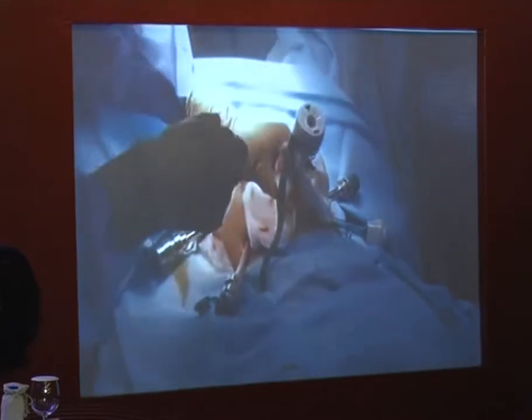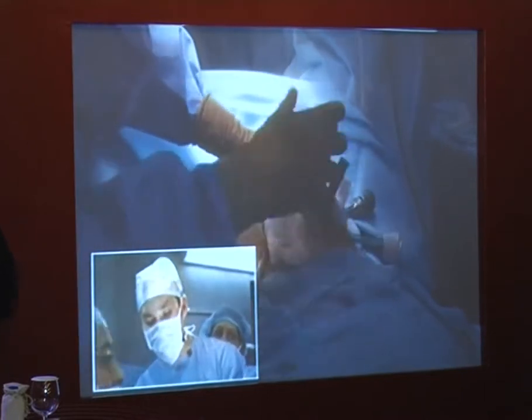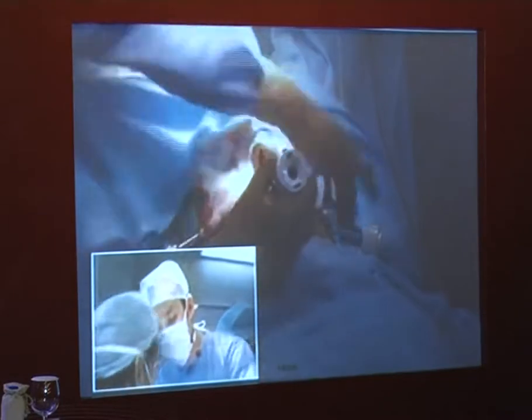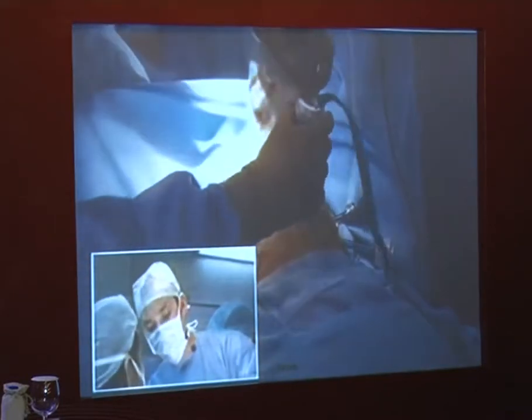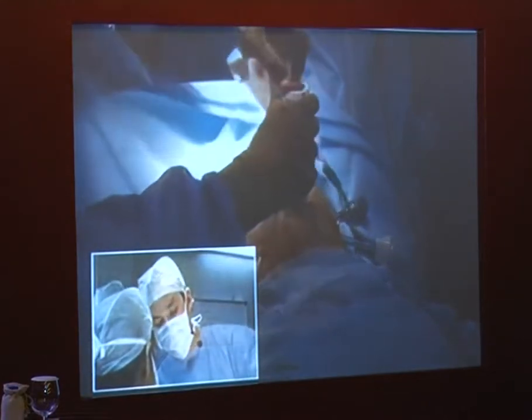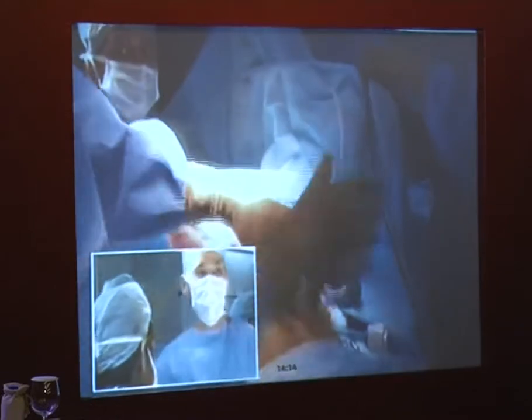Did he put the secondary ports in without visualizing, blind? Everybody wants to make sure that you put all the secondary ports in with visualization. Can you see them? When you introduced them, did you have a camera inside the abdomen? Oh, yes, we do. We have a camera inside when we put the secondary ports. It's all done under direct visualization.